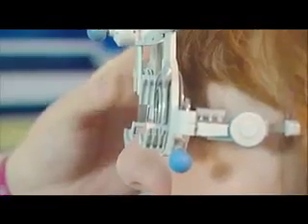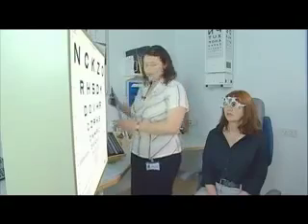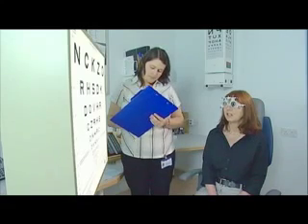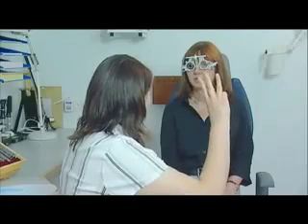A plus 0.75 diopter sphere is placed in the trial frame to correct for the one metre distance. The patient is required to read only six lines at this distance, making 30 points the maximum possible score. If letter acuity is not recordable at one metre, then counts fingers, hand motions, or light perception are recorded at one metre in the standard manner.